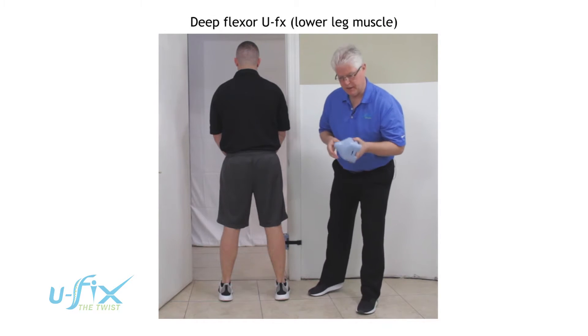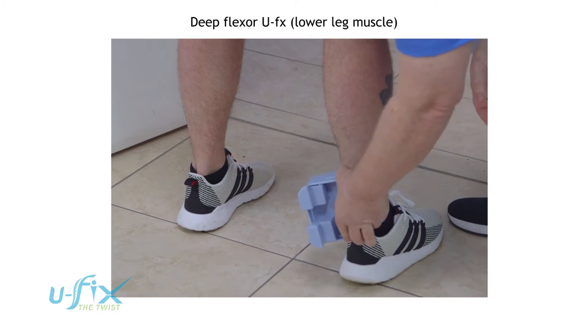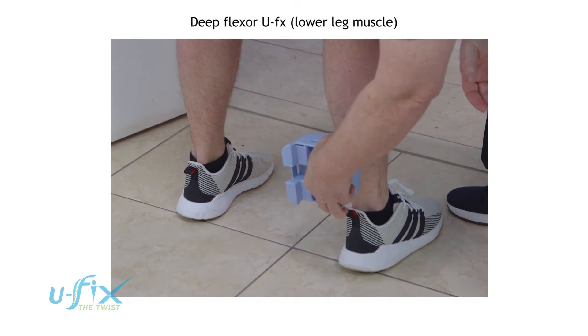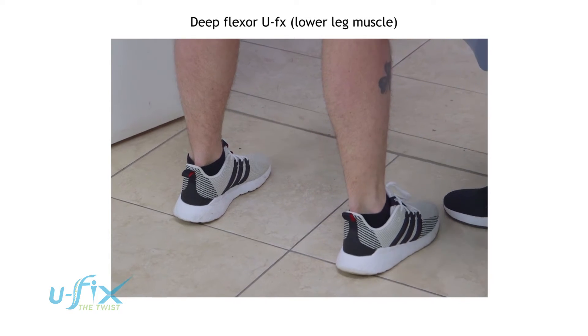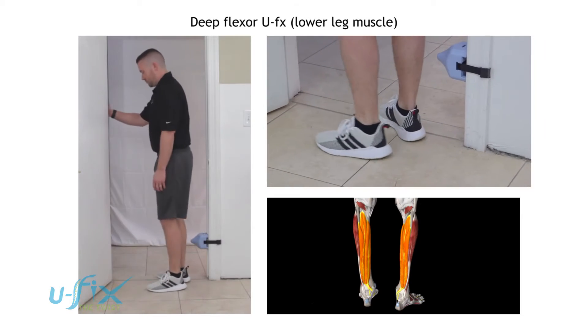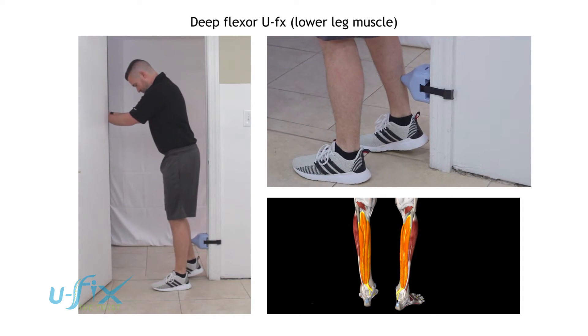Lower leg muscle. Take the U-Fix and we're going to place it down below the actual calf, so somewhere about two to three inches above the ankle. And then we're going to have the client walk over to the door jamb. He's going to have his hands out in front of him, and then he's going to put pressure against that muscle.